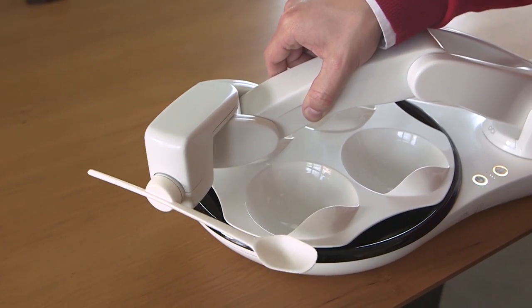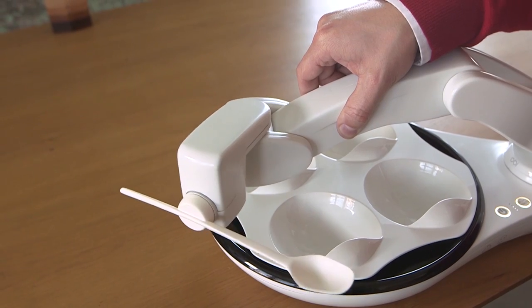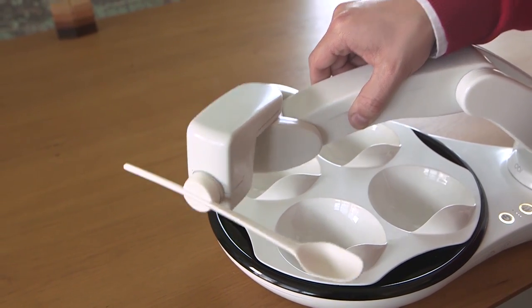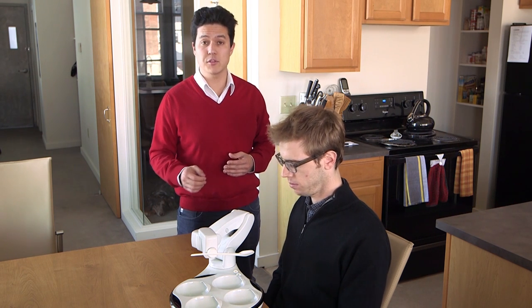There are some delivery locations that OB finds particularly stressful. If you attempt to teach to one of these locations, OB will let you know by shaking its head and quickly flashing the teach button. If this occurs, simply move the arm to a new location.